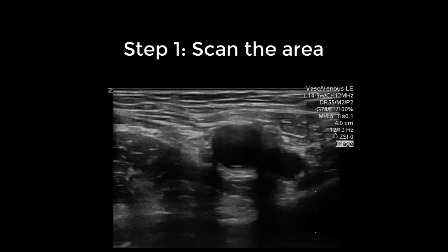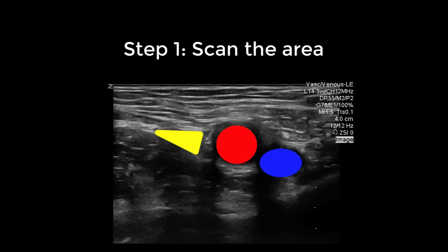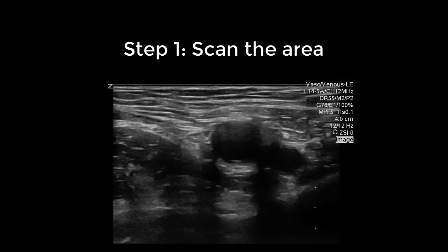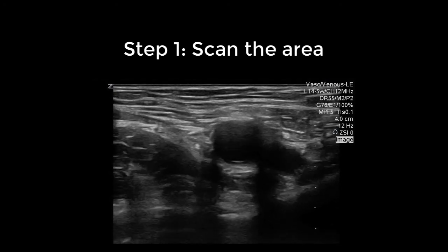Scan the area just below the inguinal ligament to identify the vein, artery, and nerve. The vein is identified in blue, the artery is in red, and the nerve is in yellow. The level of insertion of the needle is at the common femoral vein and artery where there are no branches seen.